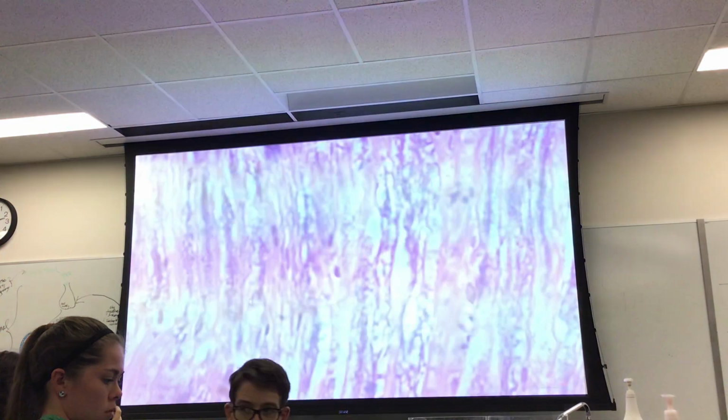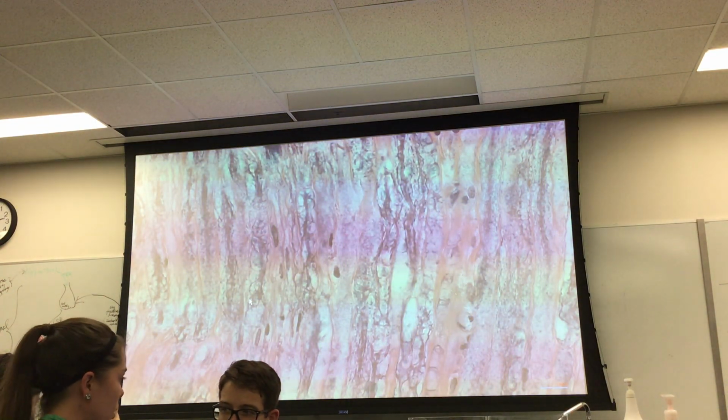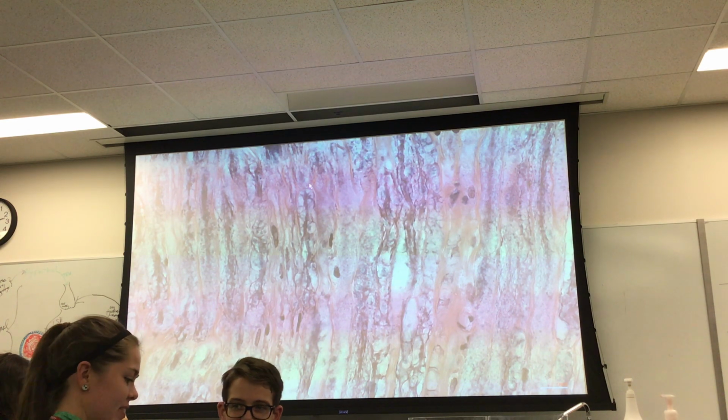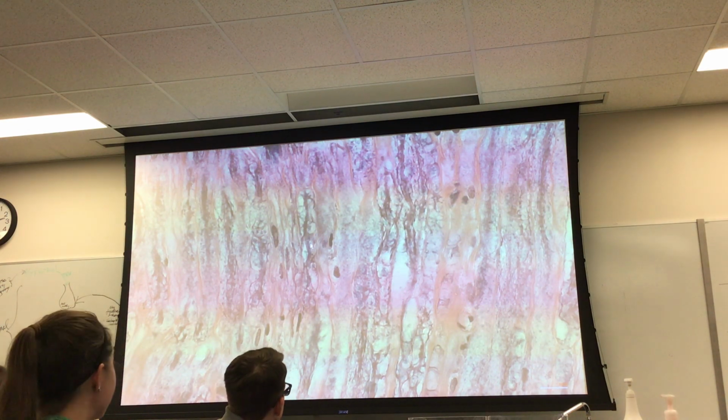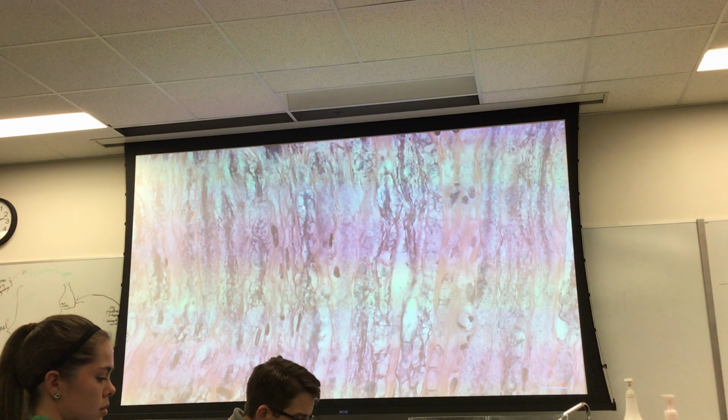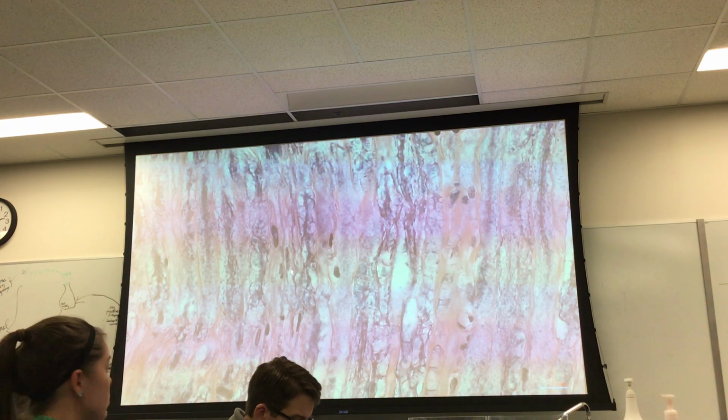And this is nerve cut in longitudinal section. As we increase our magnification here, let's take stock of some features. The axons now are going to be the purple things. Like here, for example, here is a myelinated axon. I know it's myelinated because it's got clear spaces on either side. The nuclei over here, those would be Schwann cells.